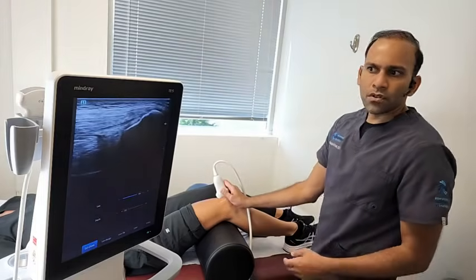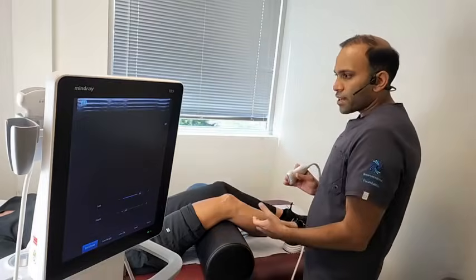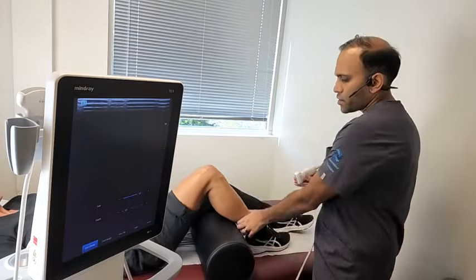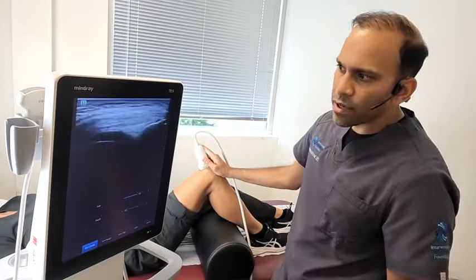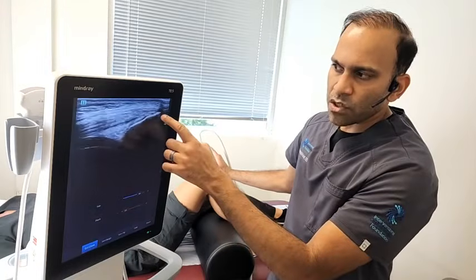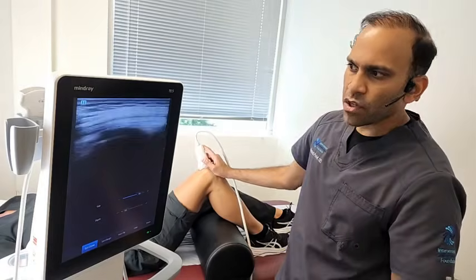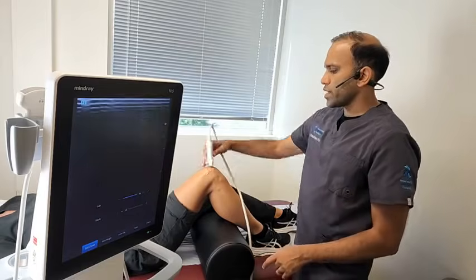Now, if we want to get a better view of this tendon and where it attaches, Alexa, can I actually have you bend your knee for me? Just like that. And now we can get a great view of this tendon coming and attaching onto the kneecap over here.